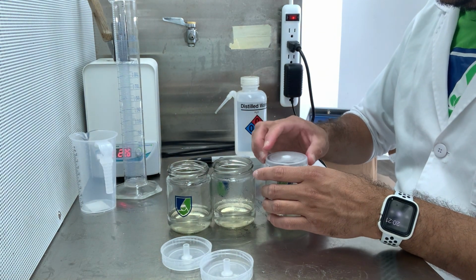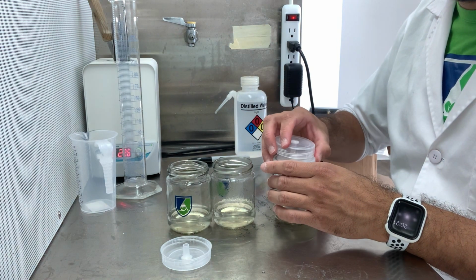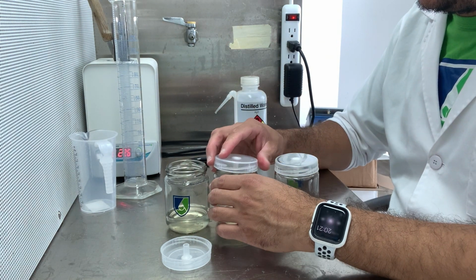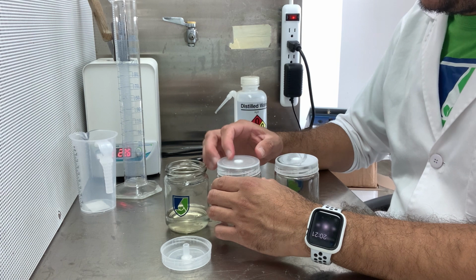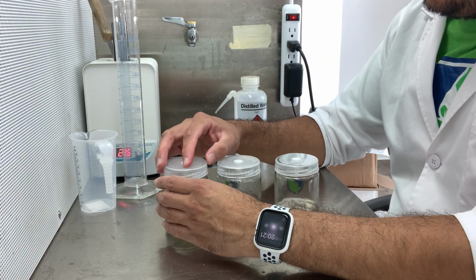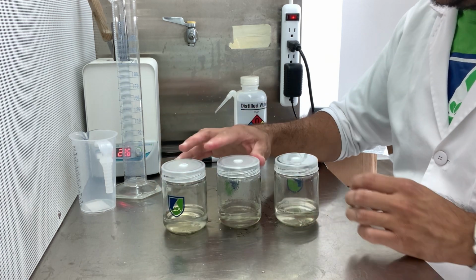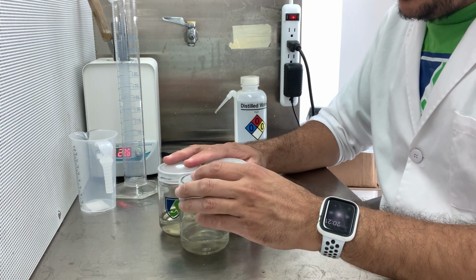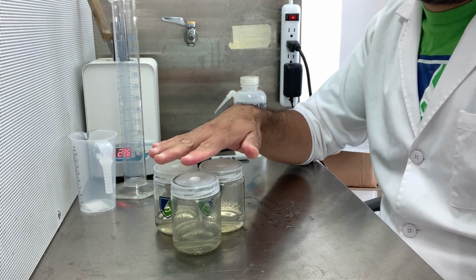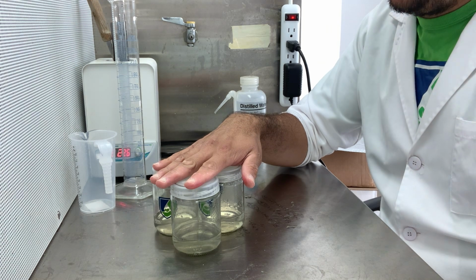So now what you want to do is put the lids on. Don't fully close it. Make sure they are loose. Even though they do have a filter, they are vented, you still don't want to fully close the container. Make sure they are loose. And now what you need to do is take this into the pressure cooker and sterilize them for 20 minutes.